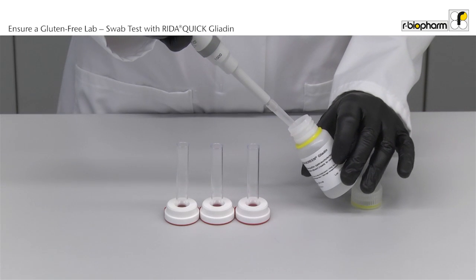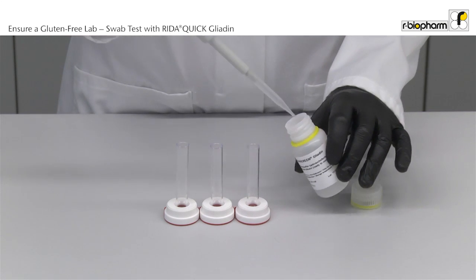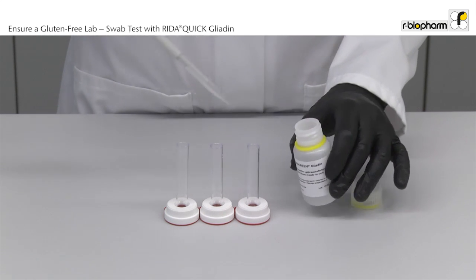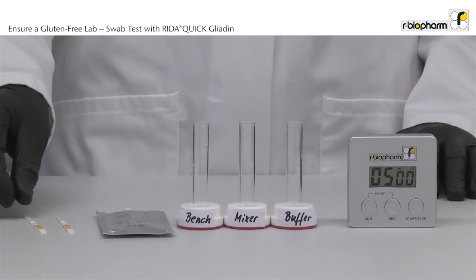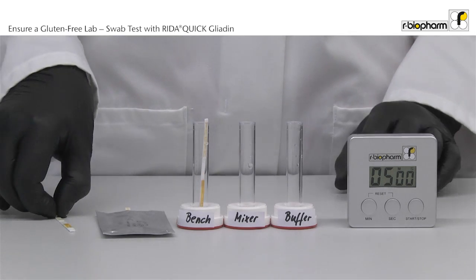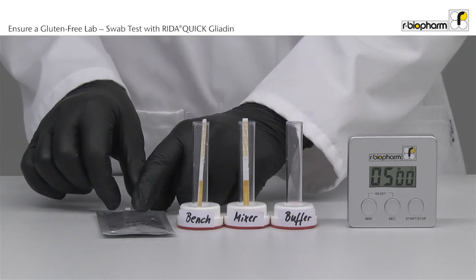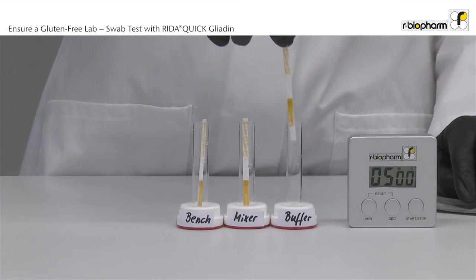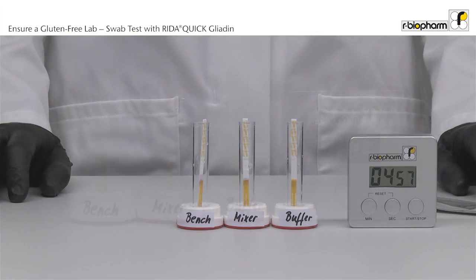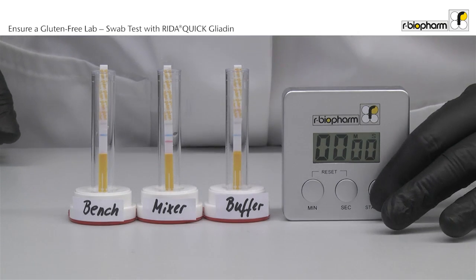Pipette 0.5 ml of buffer to the vials. Place the dipsticks vertically with the arrow end into the tube. Incubate the dipsticks for 5 minutes. Take out the strip exactly after 5 minutes and read the result immediately.